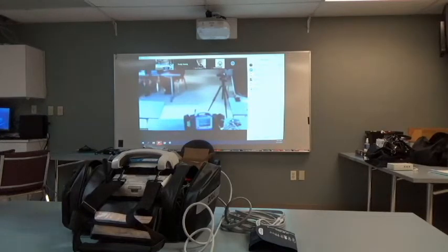Scroll down to first name, hit enter. You're going to get your alphabet. If you take a look at the left-hand side, you're going to have a row up and down, a save key, and then you have your keys on the right-hand side as well. It takes practice, but with a bit of practice, I'm telling you, you'll get fast with this. But you should use two hands. It'll make it quicker. So just a first name for today's training for the sake of time. When you're done, give me a thumbs up so I know we can move on.